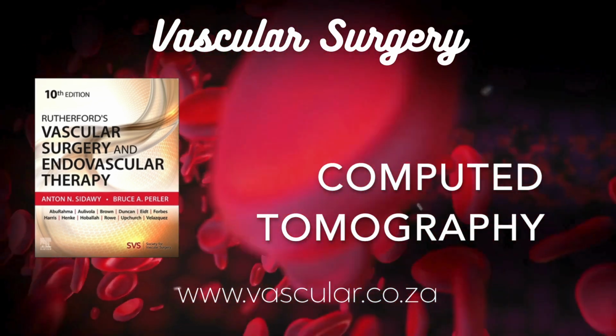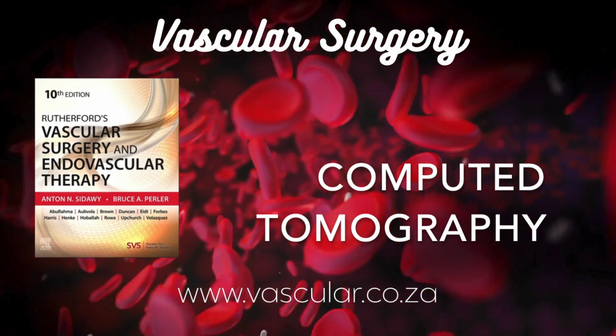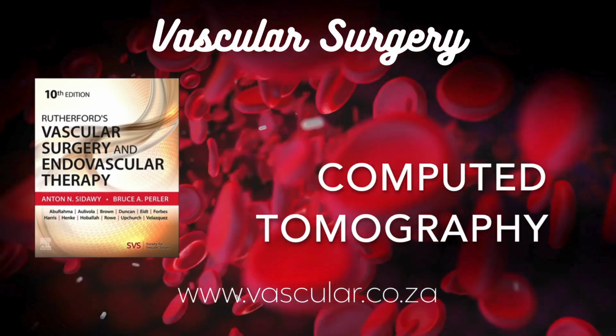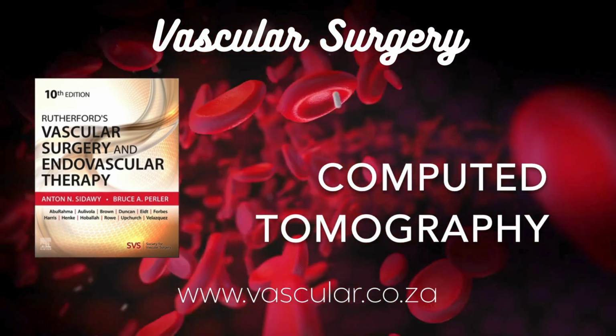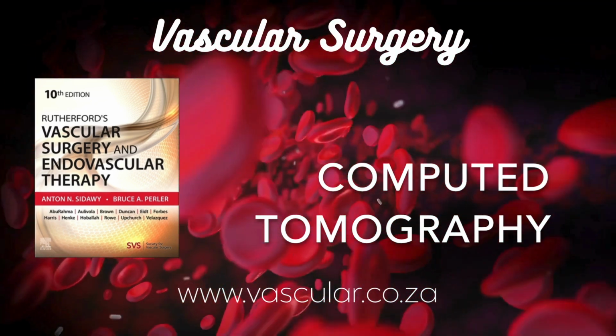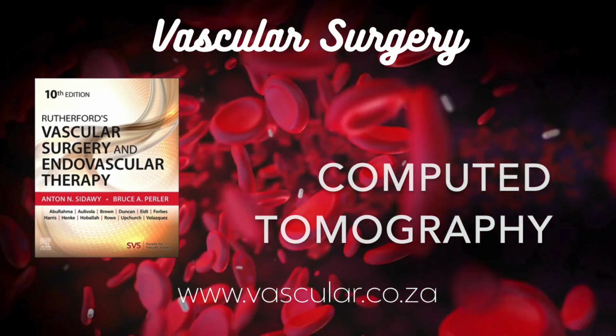Okay, aorta covered. What about blockages lower down? Peripheral arterial occlusive disease, PAOD, in the legs. Here, both CTA and MRA, magnetic resonance angiography, are generally considered excellent. CTA's strengths are speed and reproducibility. You can often scan from the aorta all the way down to the feet in one go.